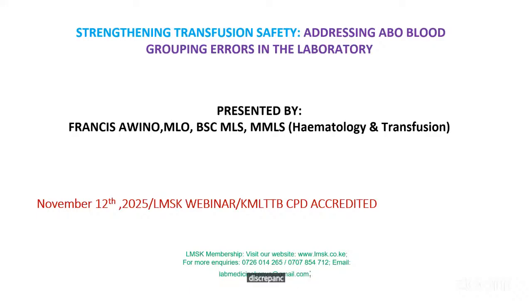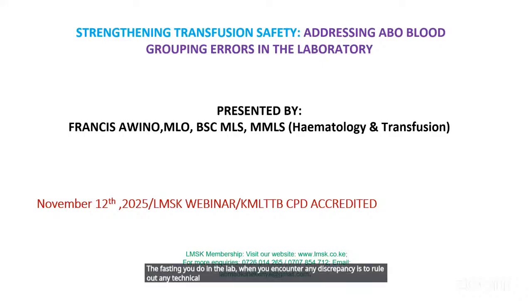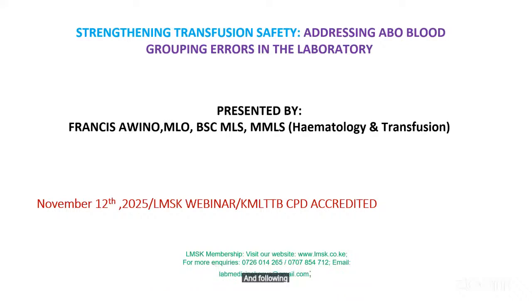So discrepancies can be as a result of technical errors. So the first thing you do in the lab when you encounter any discrepancy is to rule out any technical error. So you have to repeat the procedure carefully and following your SOP so that you capture any gap in the system. So if it is not a technical error, then you have to evaluate further.